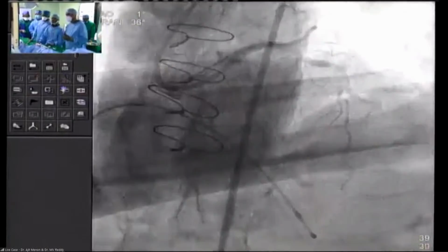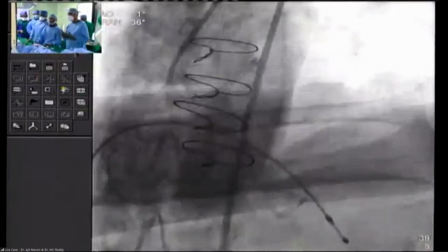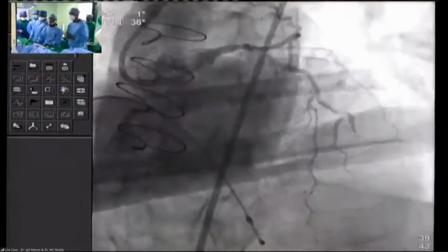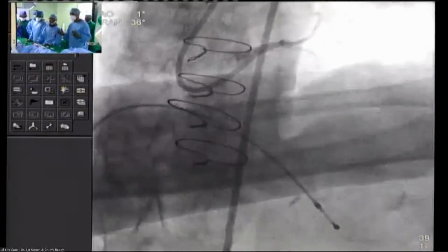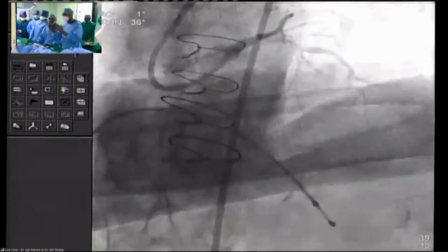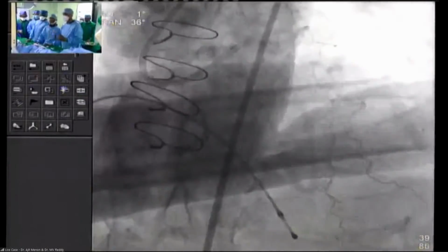So probably while trying to cannulate it, we have dislodged some plaque, or we have caused a little bit of air embolism. Yeah, it looks like air because you see how it's to and fro in the distal diagonal. Though we took all care, I don't know where. Something escaped, and he was grossly unstable with this diagonal flow being limited. The other thing that's happened is you don't see competitive flow in the LAD.